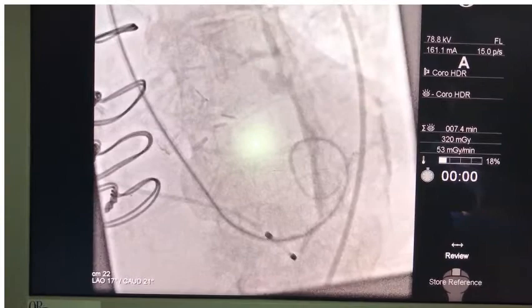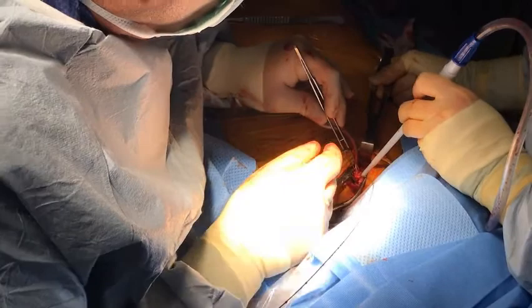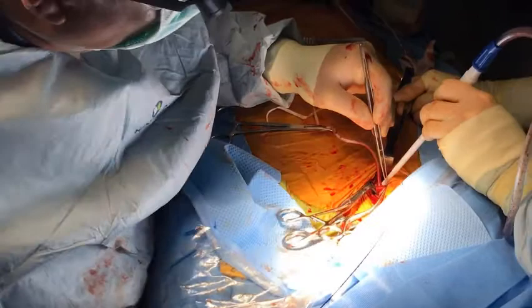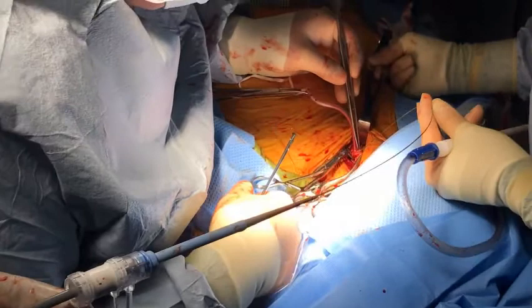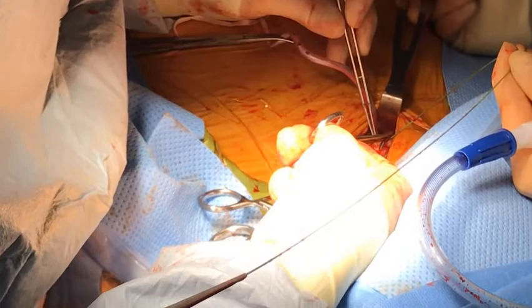The wire is then exchanged for an extra stiff wire — all of this is done through the 6 French sheath and with the carotid unclamped. After removing the 6 French sheath and with the distal carotid clamped, you want to make sure the wire is free within the arteriotomy and not sub-intimal.